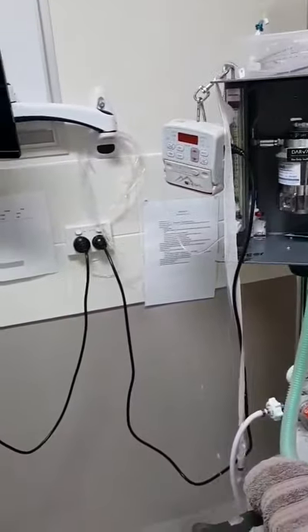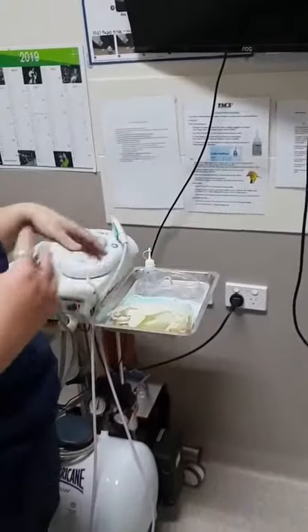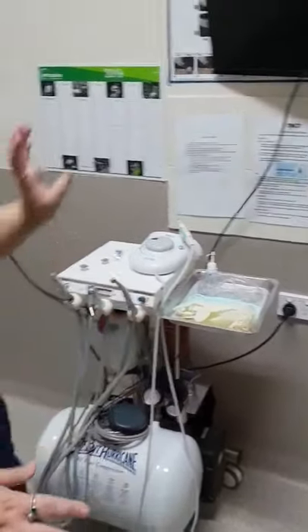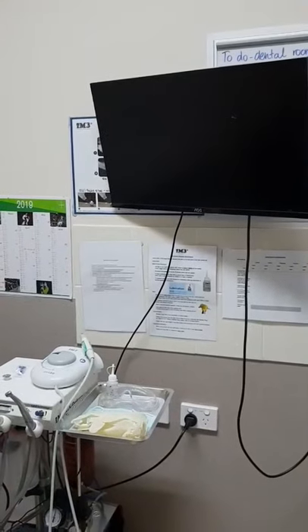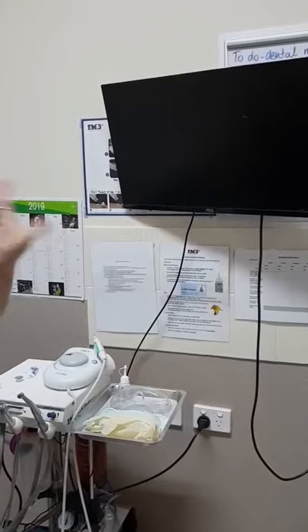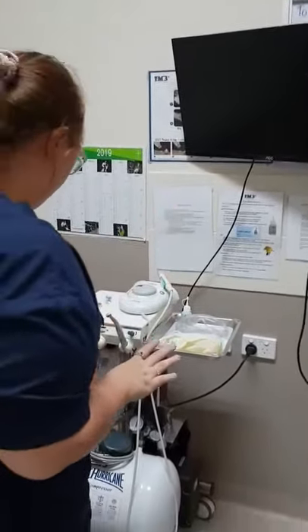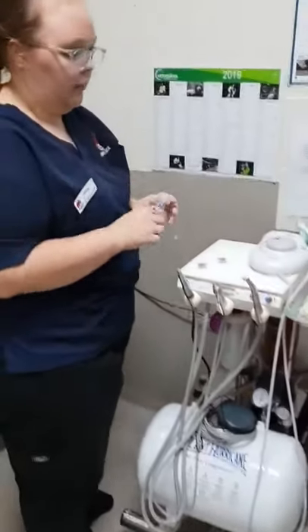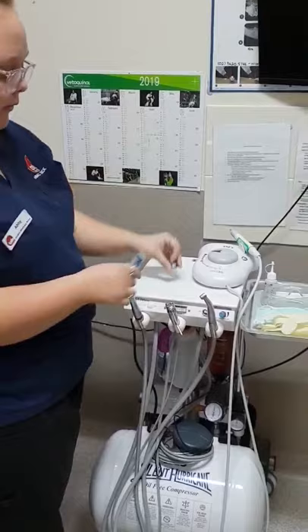We will then turn on our computer and dental machine for the dental vet. We will input all the dental patients' credentials in there. We will then make sure we have our prophy head and our toothpaste as well.